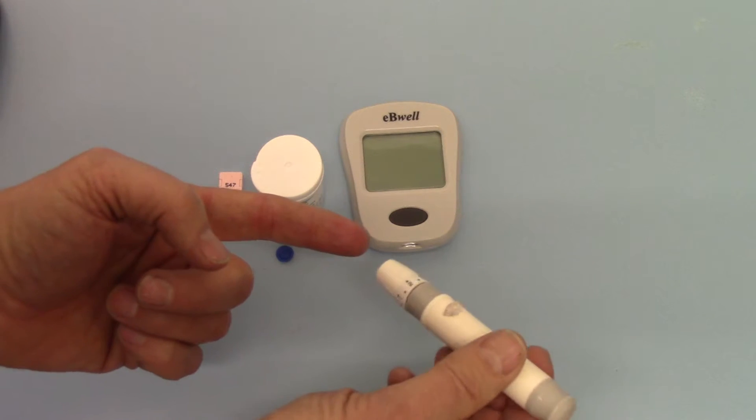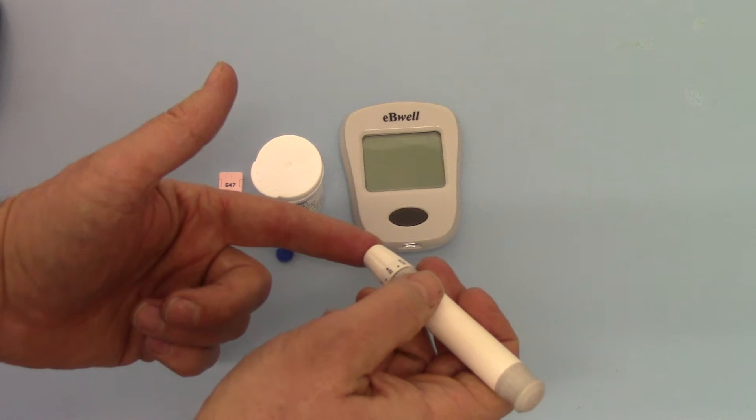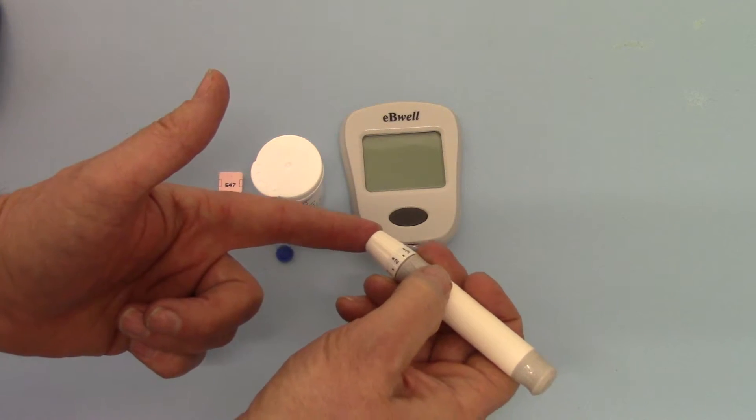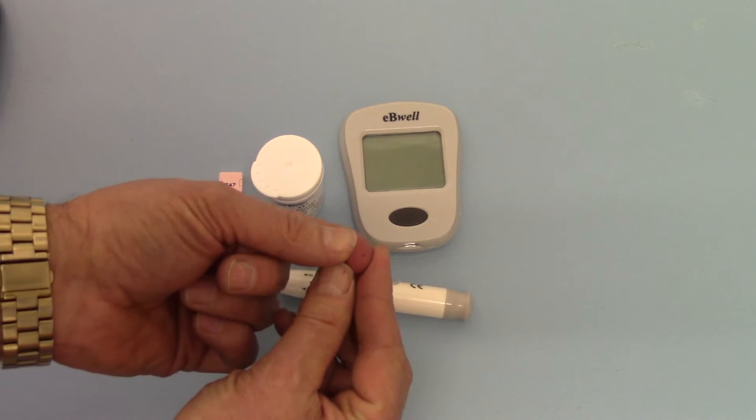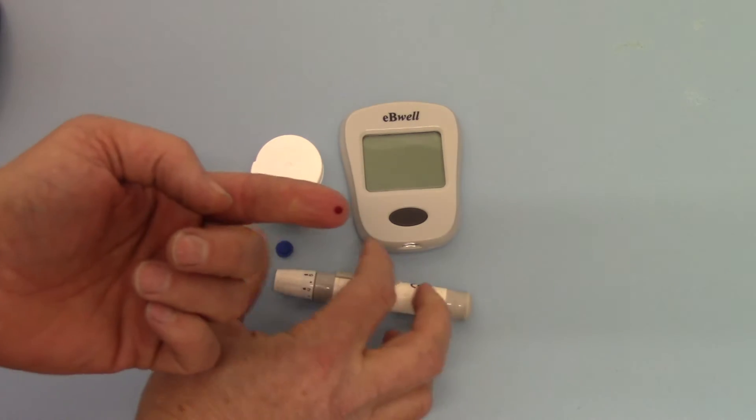So I'm going to do an auto lance on myself now. It's a little cold in here so I'm hoping it's going to adequately get a blood sample for you. To trigger the lance device you just press the button here and now we have a lovely drop of blood ready for testing.